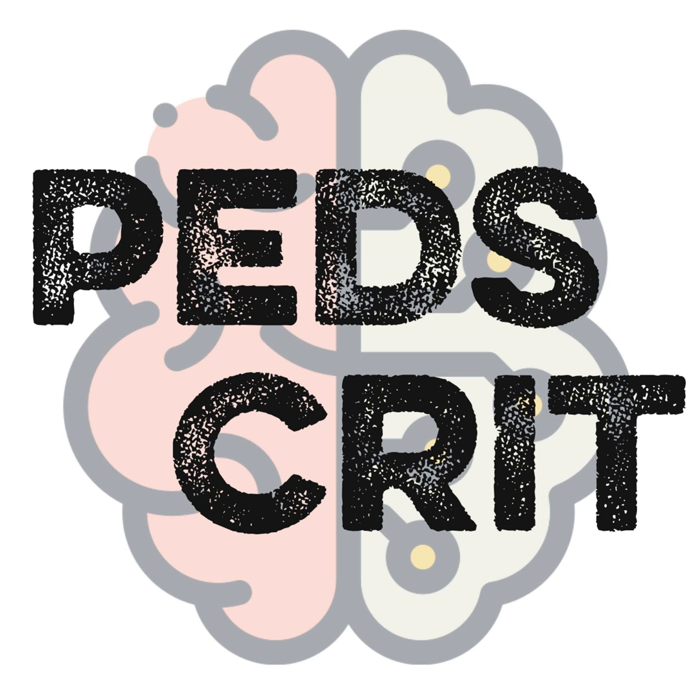And that's because you're not releasing all of the air in your lungs during that release phase because of the shorter T low. There is nothing out there really comparing these two ways of setting APRV. There are some perceived advantages to doing it with this personalized way. Some believe that maintaining lung inflation using auto PEEP may have advantages over that set PEEP and that it improves the air distribution throughout the lung.